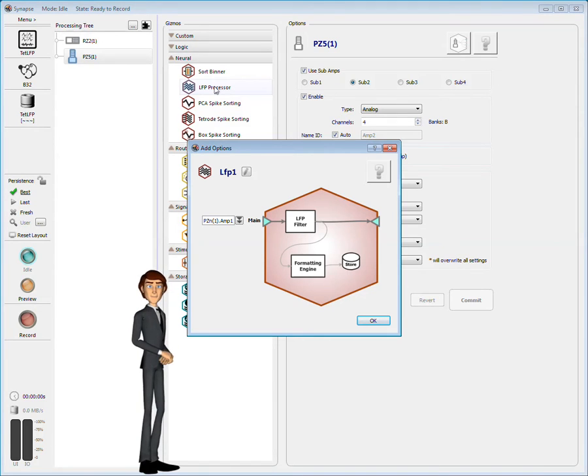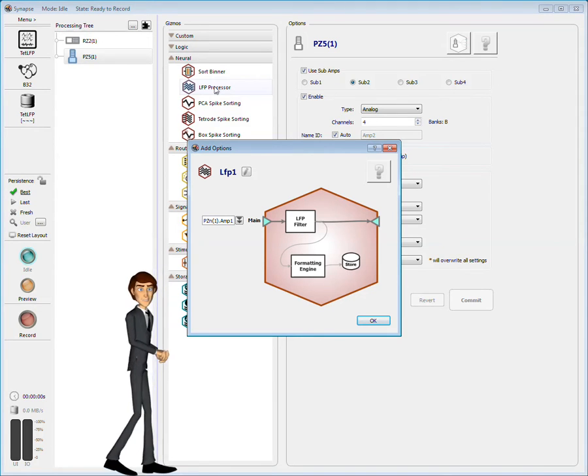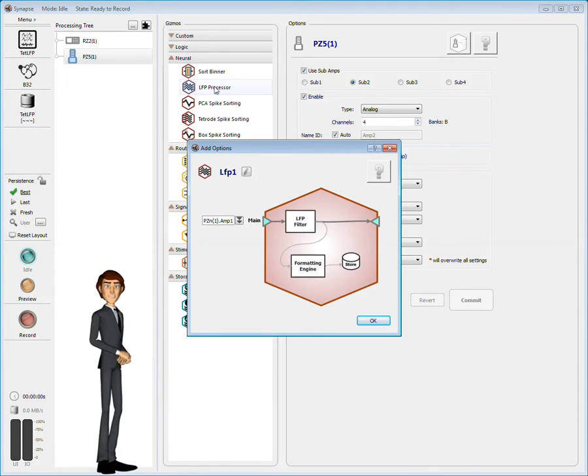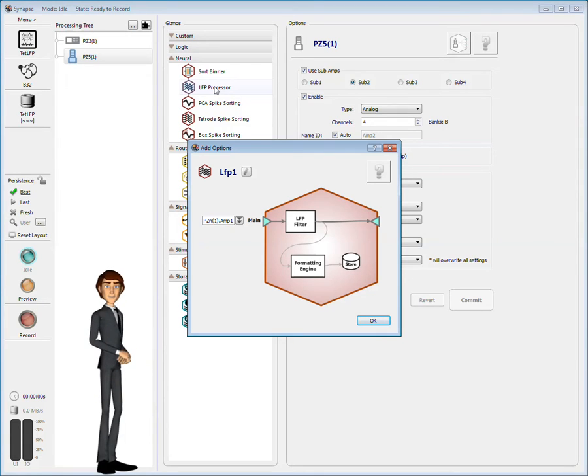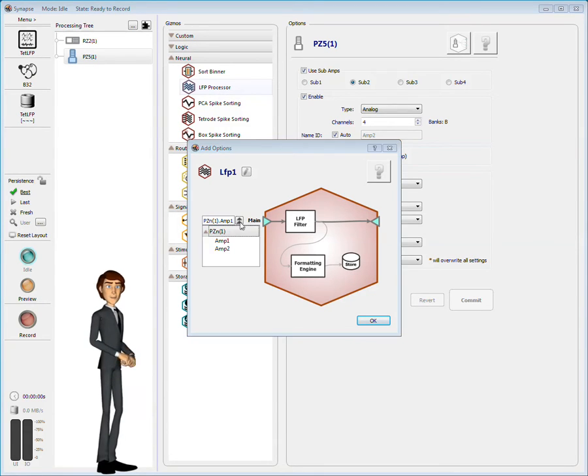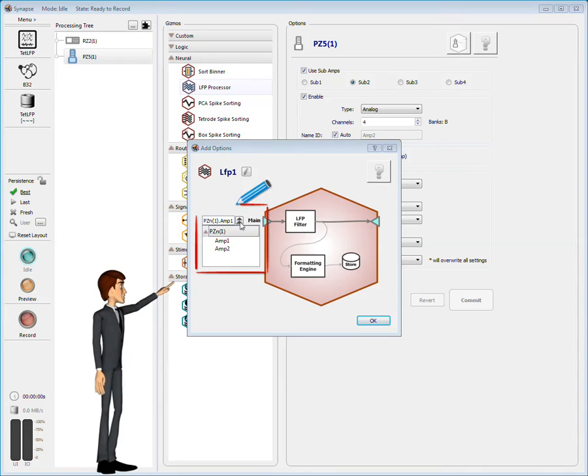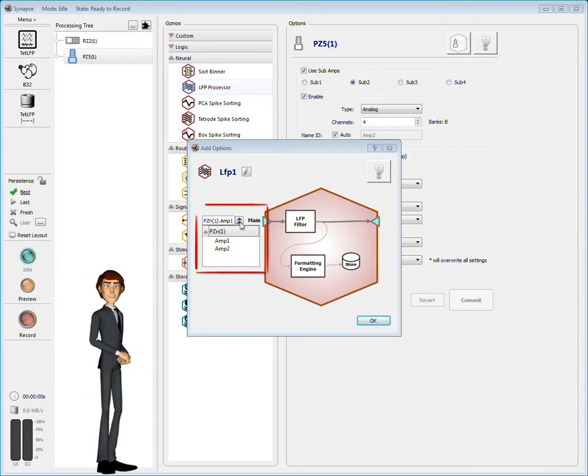Synapse displayed the block diagram for this gizmo. That means wait, take a step back and think about this. Synapse found more than one possible input source, and I need to specify which one. The two logical sub-amps configured earlier are listed under PZN1 as possible input sources.